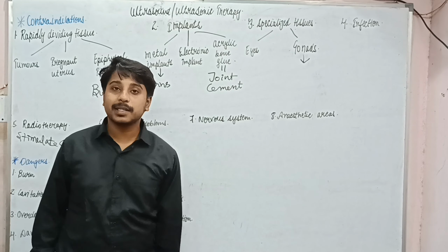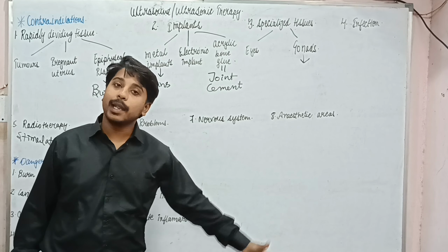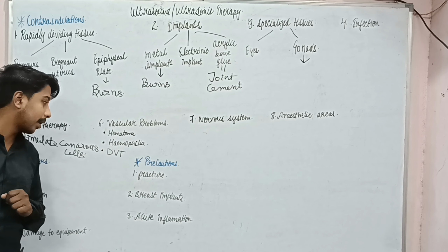Okay, next is anesthetic areas. Definitely burns can occur, so we will not apply ultrasound here.